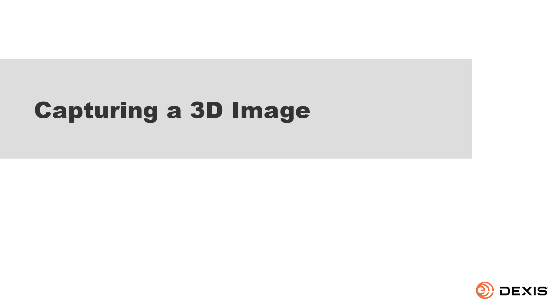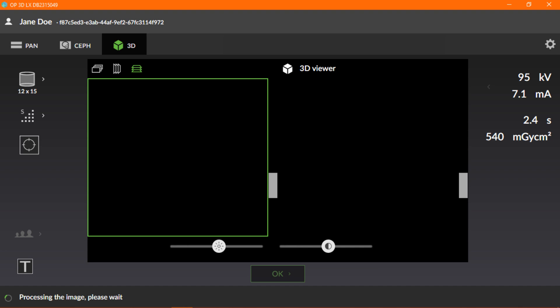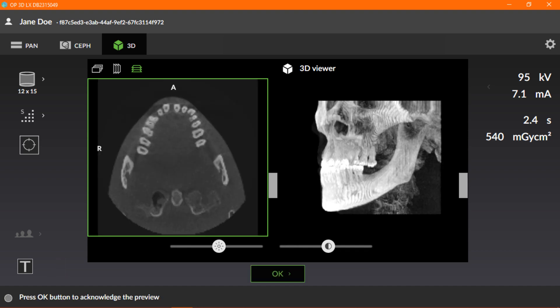Now, let's capture the 3D image. The device will prepare the image, and the status message bar will display the message, processing the image, please wait. A preview image of the 3D scan displays on the GUI for review. Now, let's move on to the next section.